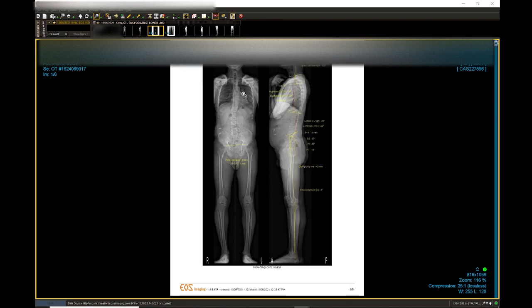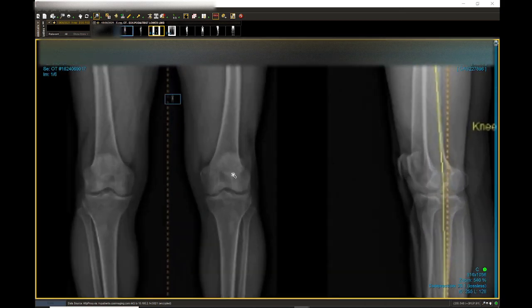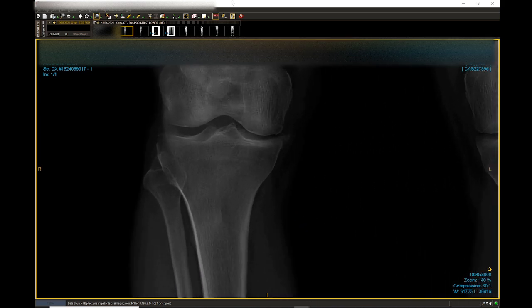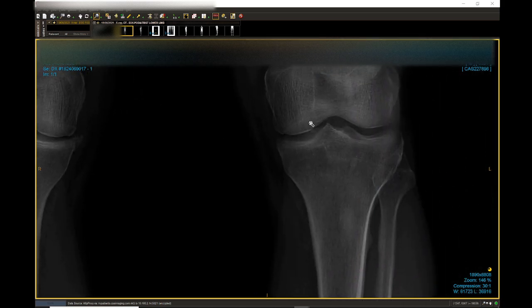All right, and at the same time, like I said, we're able to zoom in, and so we can have a look at the hip position, and we've found many kids, for example, that have hip dysplasia. So you can zoom in, have a good look at the actual knee, say a little bit of spurring there. So this person's got a little bit of medial knee arthritis. Okay, so if I want to investigate further, I might send for x-ray at different angles.